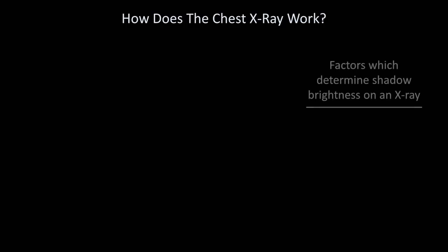So what are the factors that determine how many photons pass through a particular spot on a patient to reach the detector? In other words, the factors which determine shadow brightness. There are essentially three. The first is the density of the interposed tissue. Technically, this depends not just on the literal density as mass per unit volume, but also independently on the atomic mass of the particles in the interposed tissue.